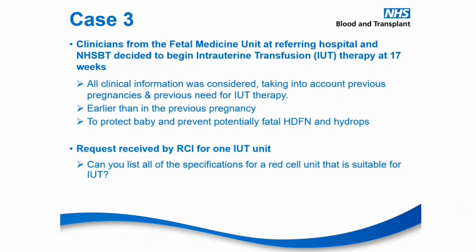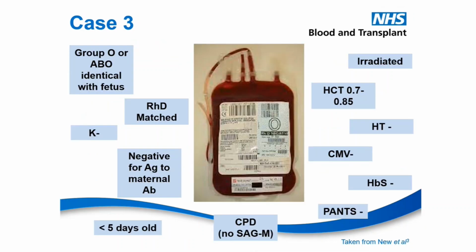So the request was received by RCI for one unit of IUT. So a little bit of interaction now from you guys. Can we list all the specifications for a red cell unit that's suitable for IUT? We'll pop it in the chat. We'll give everybody a minute for some of these suggestions to come through.